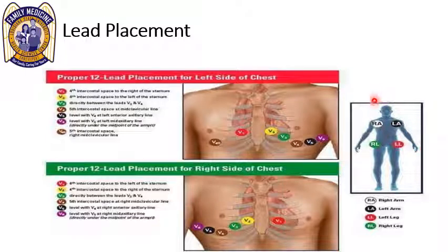So on the right here, we have the 4 lead placement. You have your right arm, right leg, left leg. And usually you'll see them put onto the trunk, and that is perfectly okay. The alternative is putting them on the distal aspects of the extremities, which is also okay. Some schools of thought will say this is actually more effective because it's getting you the furthest potential. In the hospital, very rarely will they ever put a 4 lead on the arms and the legs. They'll literally just put them on the chest and the abdomen.